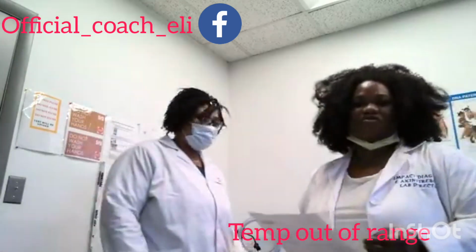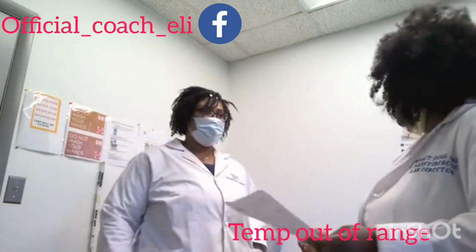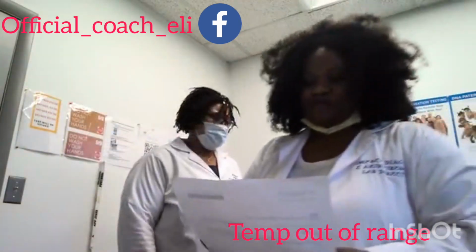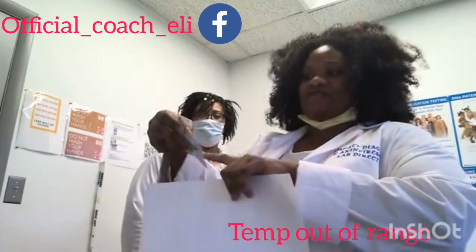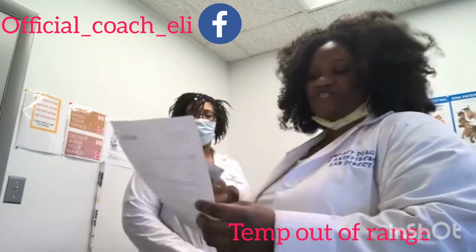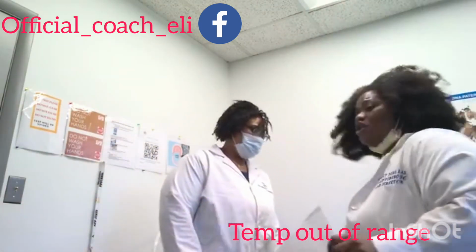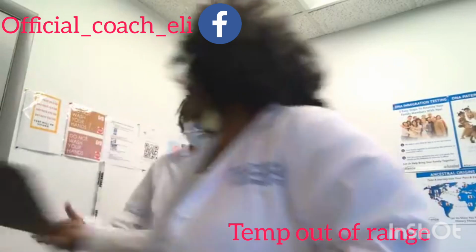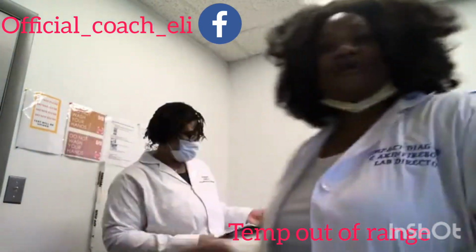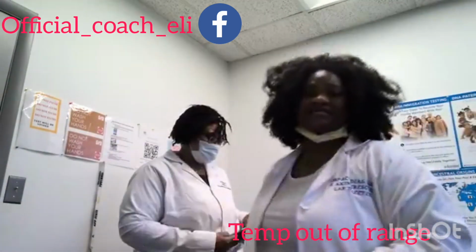Sure. So you would go ahead and ask for their authorization and then their ID. Can I see your ID, ma'am, please? All right, thank you. I'm going to make sure I look at the name, that it matches with Ashanti, and of course matches with the authorization form. Great. All right, Ms. Ashanti, could you please sign in? I'm going to give her my sign-in sheet, and I'm also going to give her an authorization form so that she can authorize me, that's the consent to treat.